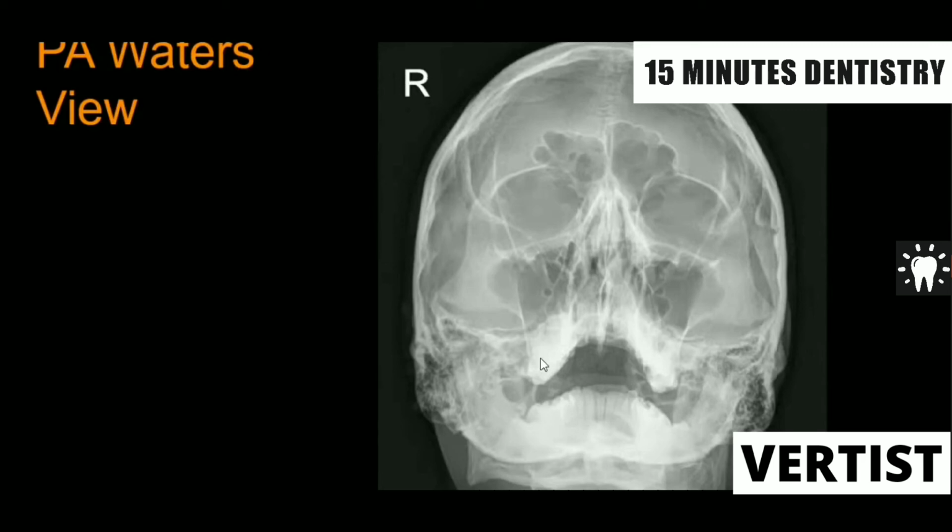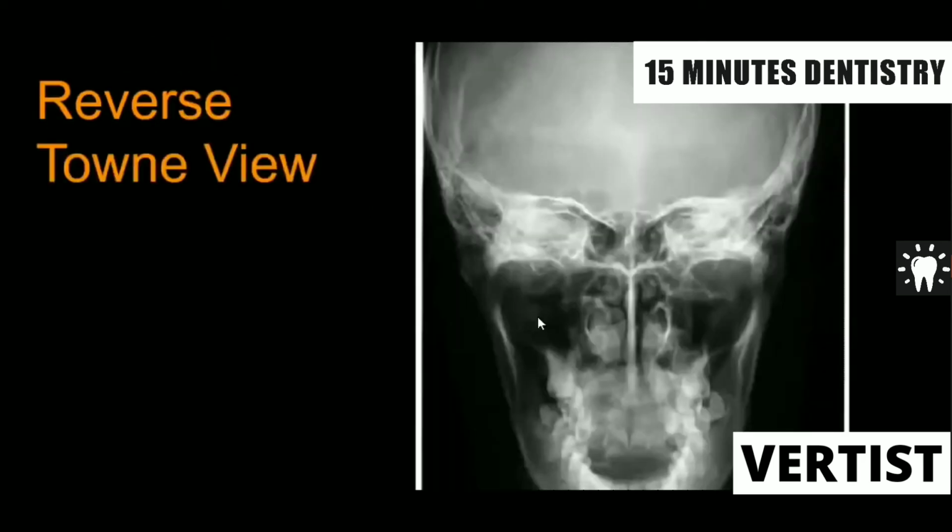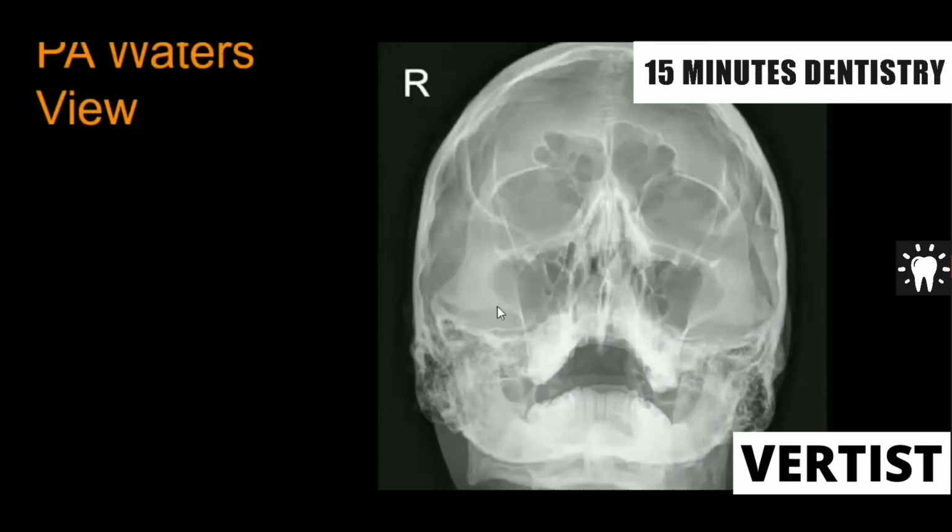So it is always indicated to see the maxillary sinus and the zygomatico-complex region, that means the main buttress, zygoma bone, zygomatic arches, the orbital walls and the nasal septum. Okay. So the placement of the film and all this that I told you, you should go to the reading. The indication for this is always to see the pathologies of the maxillary sinus, the palate and the oral cavity.